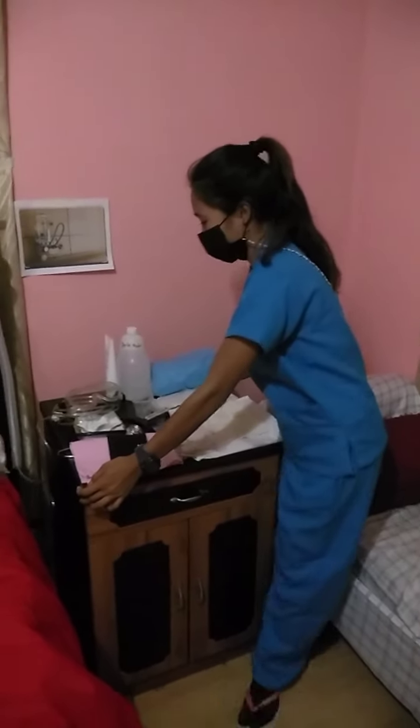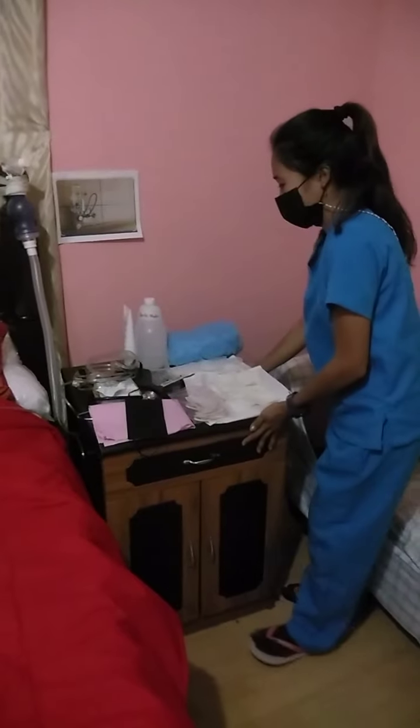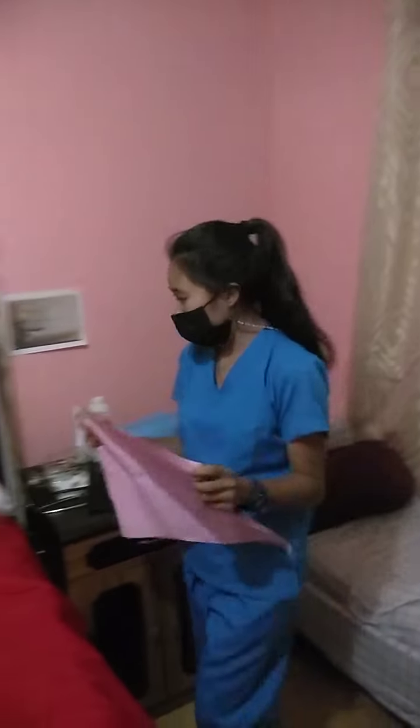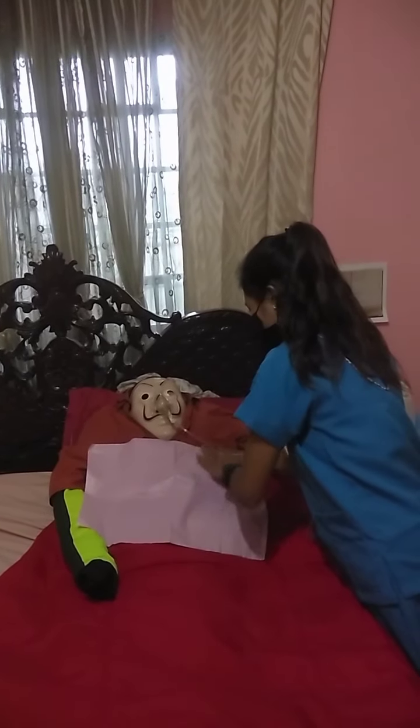Move the bedside table close to your work area and raise it to waist high. Place the towel or waterproof pad across the patient's chest. Then, place the pulse oximeter on the patient's finger and leave the device in place.